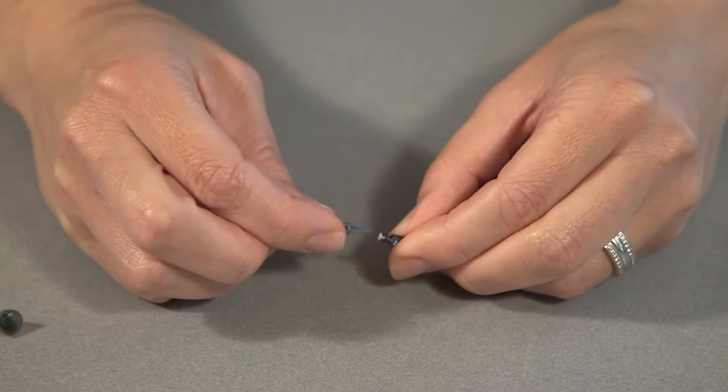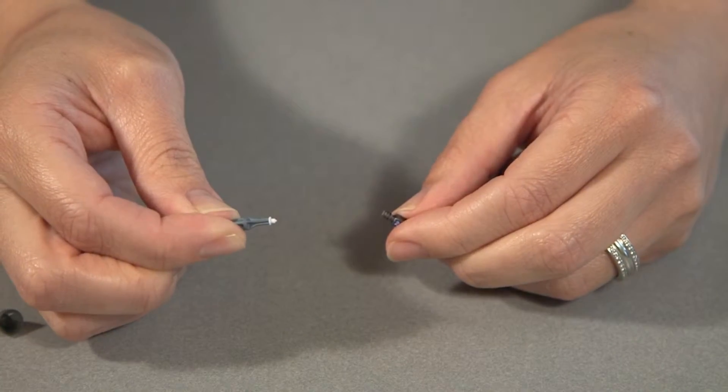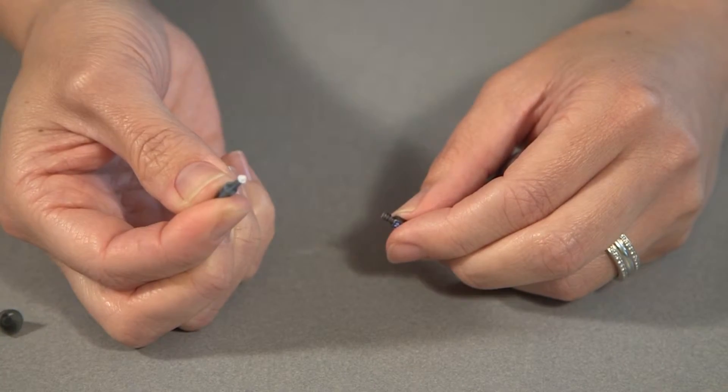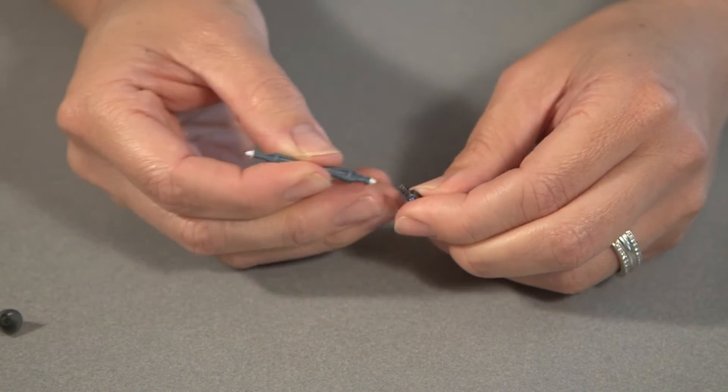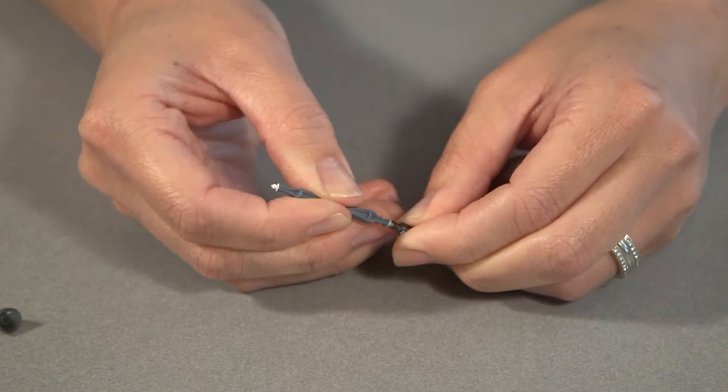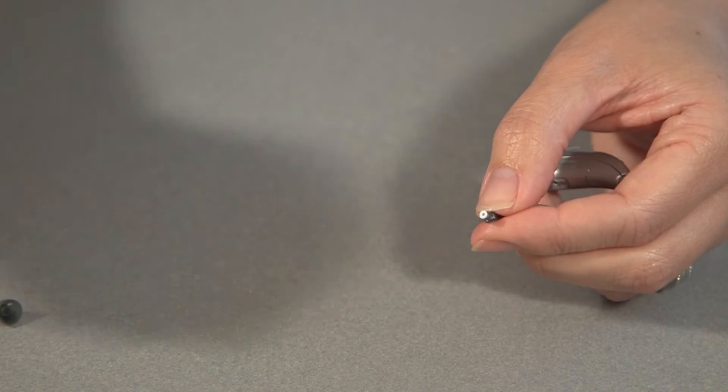And you just push it in, push the stick in and pull out the dirty wax trap. Turn the stick around and insert the new one. And then this can be tossed into the garbage.